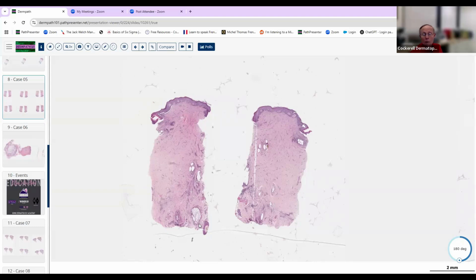If it's inflammatory, where is the inflammatory infiltrate located? Does it target the blood? Does it target the follicles? If it does, which part of the follicle is attacked? Is it attacking only the infundibulum and the isthmus area, or is it attacking the base of the follicle near the hair bulb area? Is the inflammation not targeting follicles?